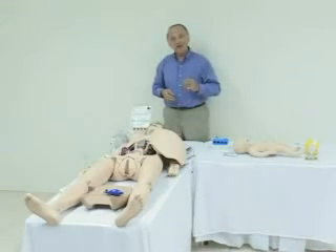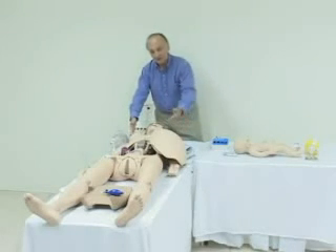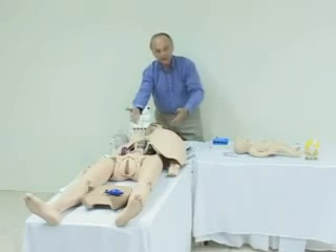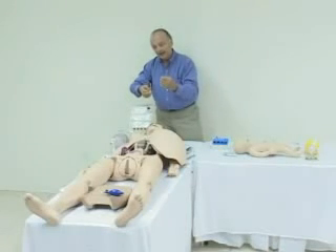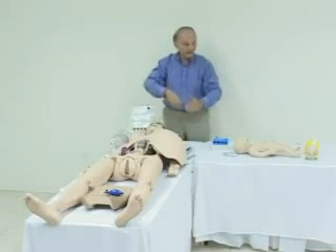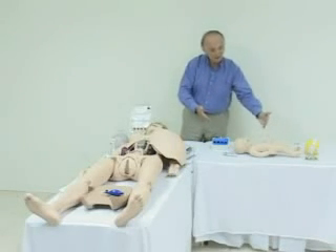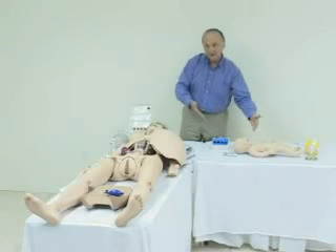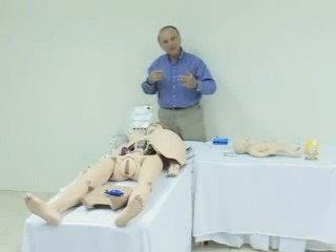Now let's review. The Noelle 550 contains the articulating adult, the automatic birthing mechanism, the birthing fetus that births from the ROA position, the placenta, the removable cervix and vulval inserts, the device for doing Leopold maneuvers, as well as the neonate that can be intubated orally or nasally and via umbilicus, as well as CPR. The 550 and the 551 are two of the five systems we've developed for obstetrics and management of obstetrical emergencies. Thank you. We hope you've enjoyed the show.